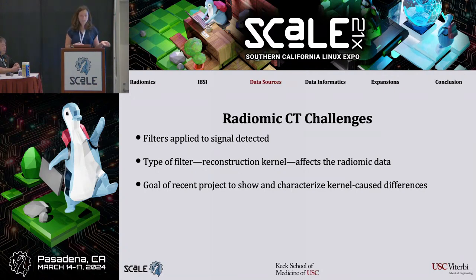The Toshiba CT scanner we used, with those 58 differences, it's all based on what window you're trying to view. So even though the Hounsfield unit is a unit of density, when you have those different windows, there's a bone window, there's a lung window, there's different densities of different tissues that you optimize your reconstruction kernel for, and that does present itself in the scan later on.